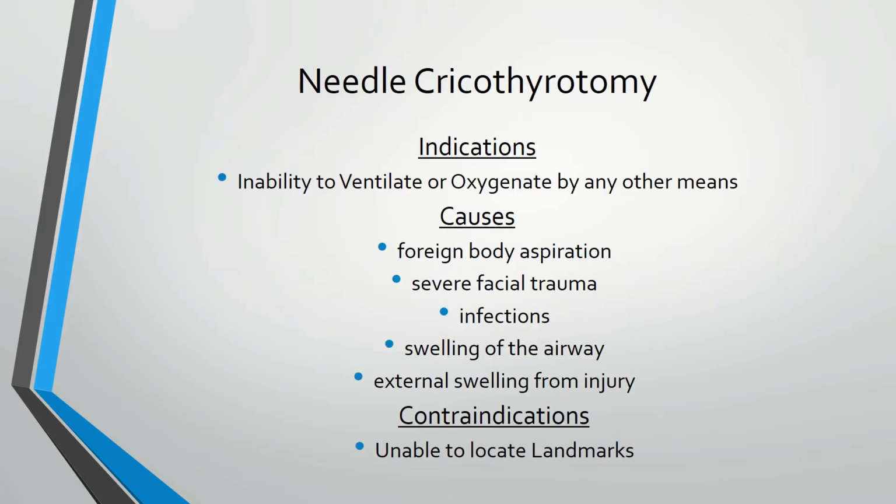So what are our indications? The end-all indication is your inability to ventilate or oxygenate your patient by any other means that you have on hand or that you've attempted. Different protocols will lay out different indications, but that's your main indication: you're unable to ventilate or oxygenate that patient. What are some of the causes that may lead to this inability?